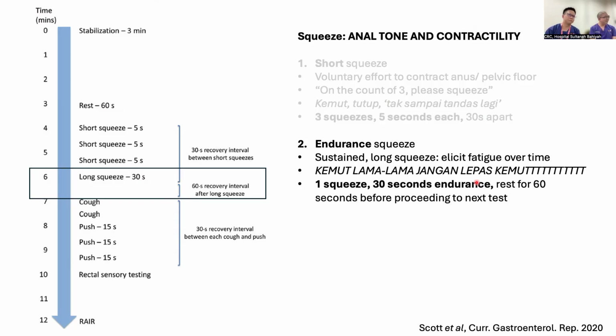If, let's say, a young patient comes in with chronic constipation, do we still subject them to a colonoscopy and only then think of this test, or can we straight away think of this test before, in the event the patient doesn't have any red flag signs? Can we straight away do this, skipping the colonoscopy, or do you still do the colonoscopy and then do this? Good question, especially when it's a young patient.